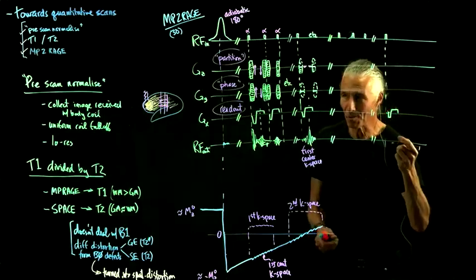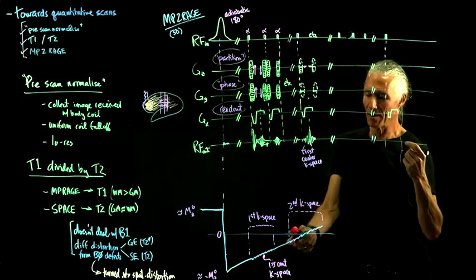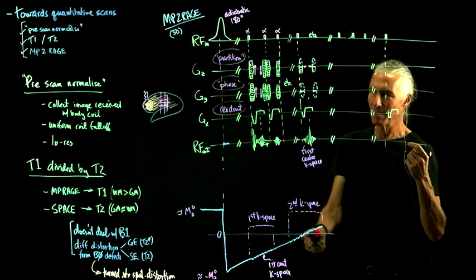And in this one, we want the gray matter to have recovered to 0 and the white matter to have recovered above 0.